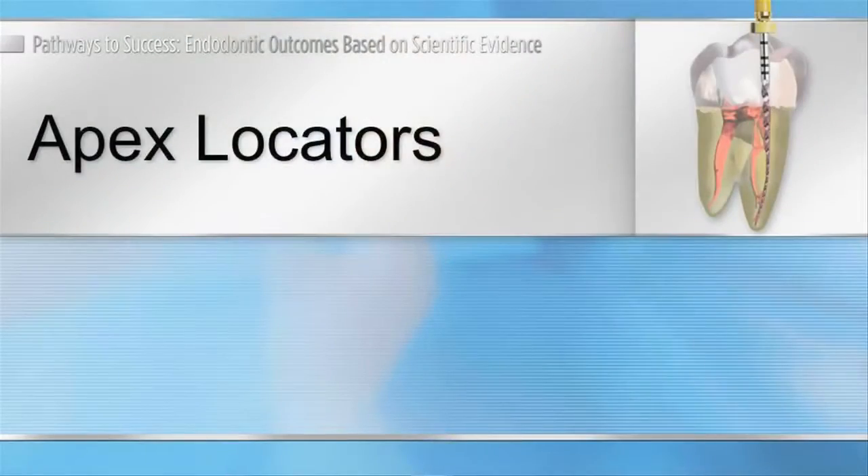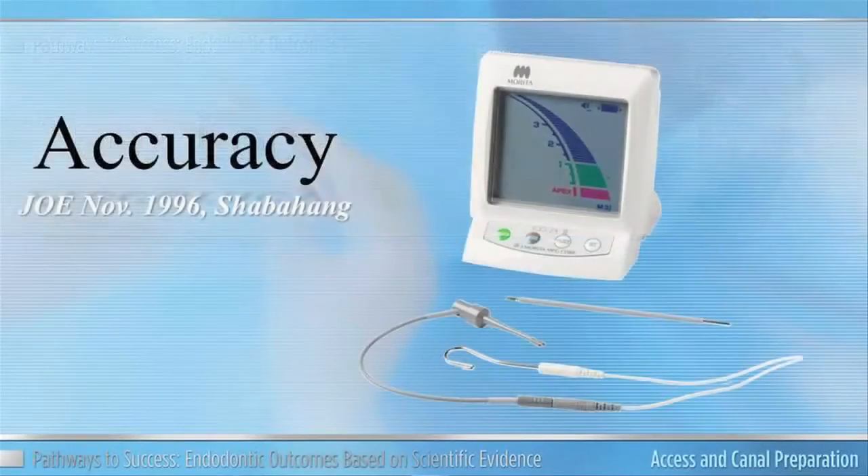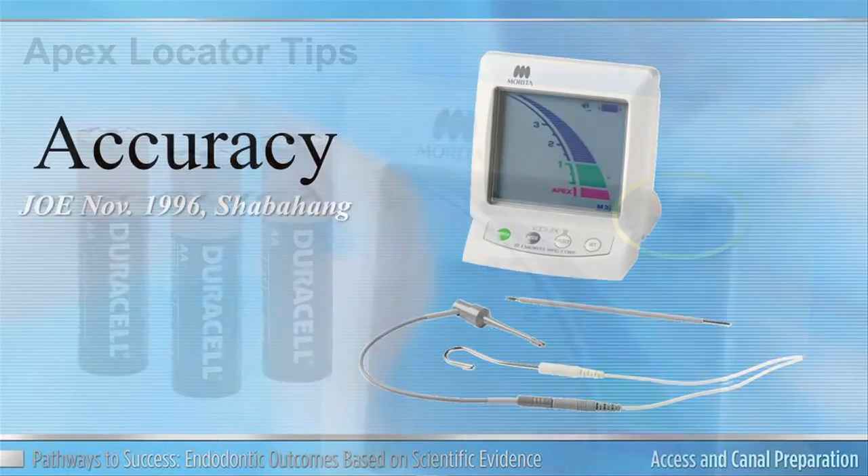The apex locator back in 1996 was shown to be 96% accurate by a research study done by Shabahang. One thing I want to do today is review some simple tips that can increase your accuracy and ease of use with the apex locator.